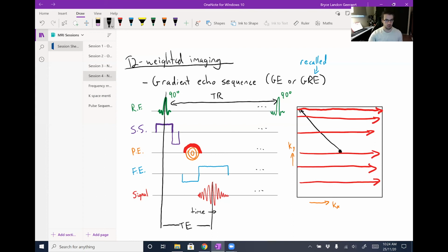Like I talked about before, k-space is defined by having the general contrast of the image, the bright fuzzy whites and the dark fuzzy darks, in the center. That's where your general contrast is. And then on the outsides, there's all the fine details that don't define as much of the image, but are still very important, so we can actually have high resolution and distinguish between structures and all those kinds of things.